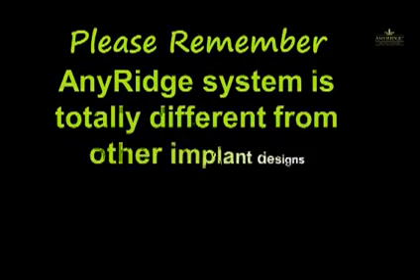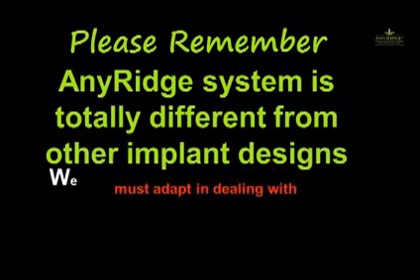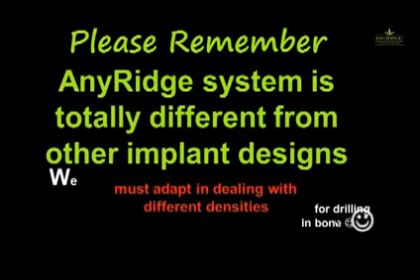So please remember, the AnyRidge system is totally different, as you can see now from the different drilling guides that we've performed, really different from other implant systems. Bottom line is, you really must adapt in dealing with different bone densities. Do you have to think a little bit more with this system? Yeah. And the reason is because we're not drilling into wood. You can't just push on the bone, and you really shouldn't do that, because that's where you end up burning the bone, because bone is, as we all know, living tissue.